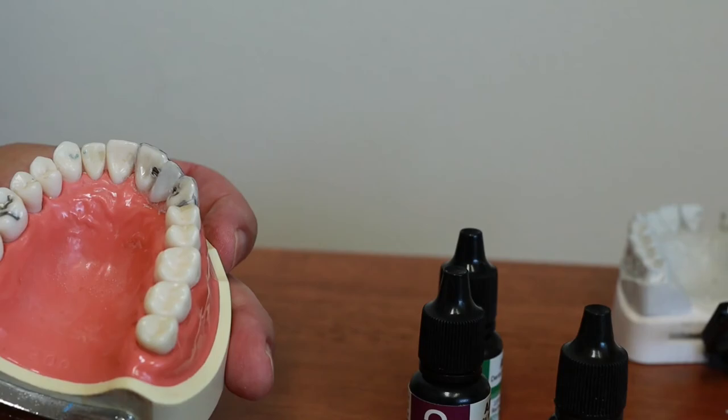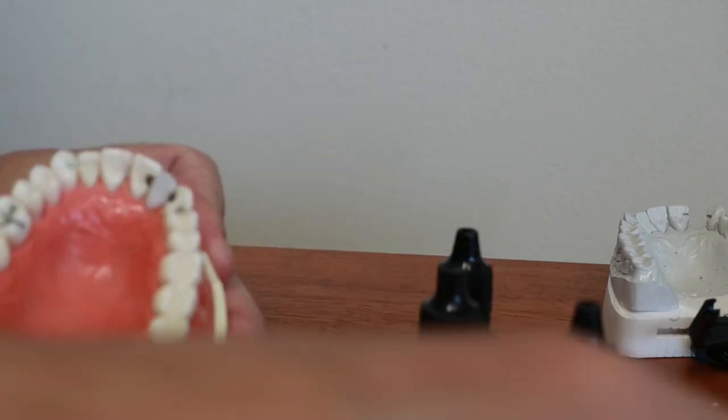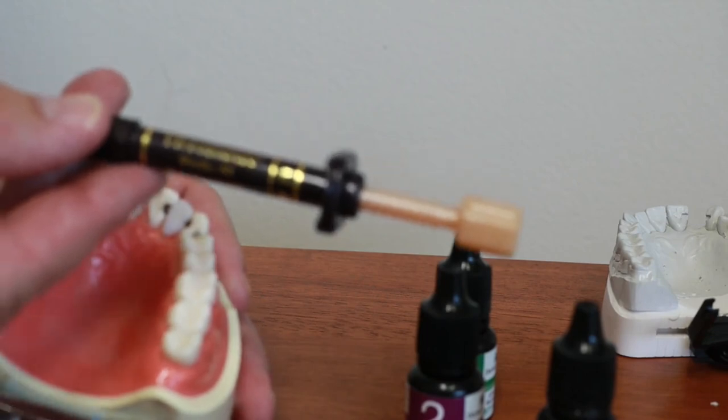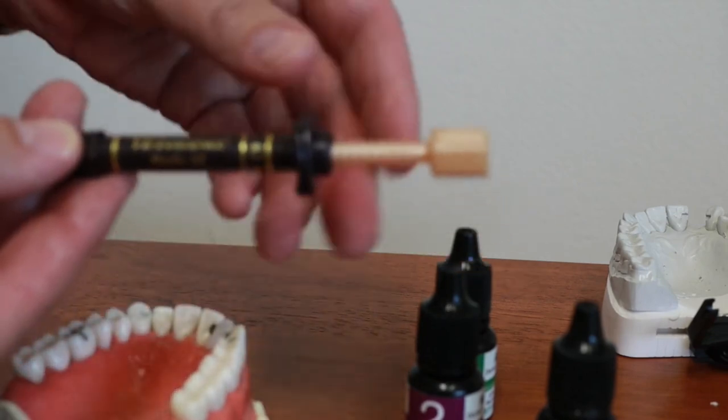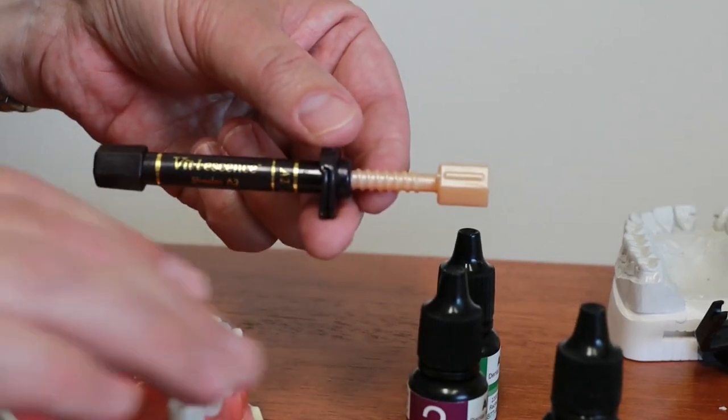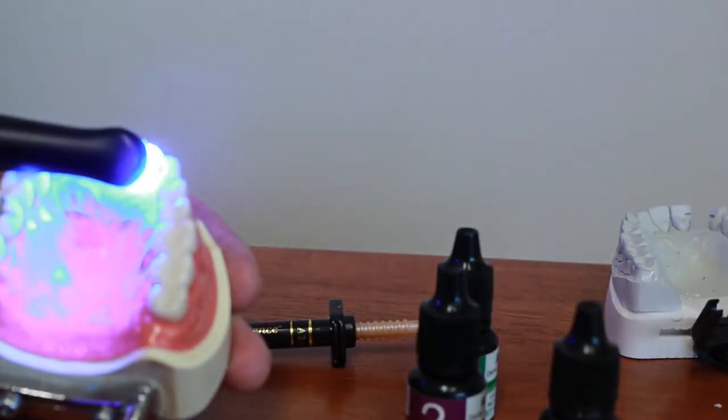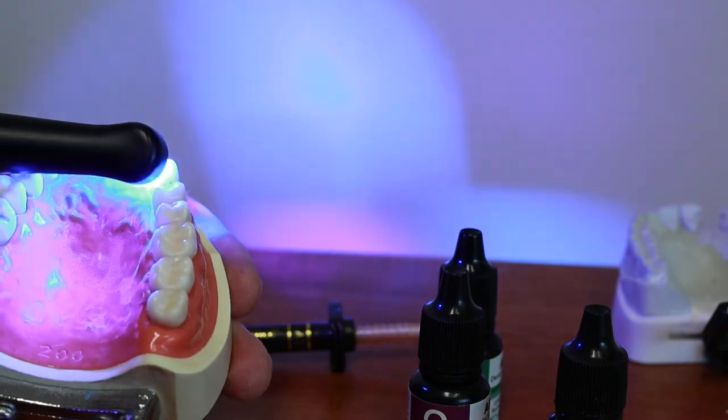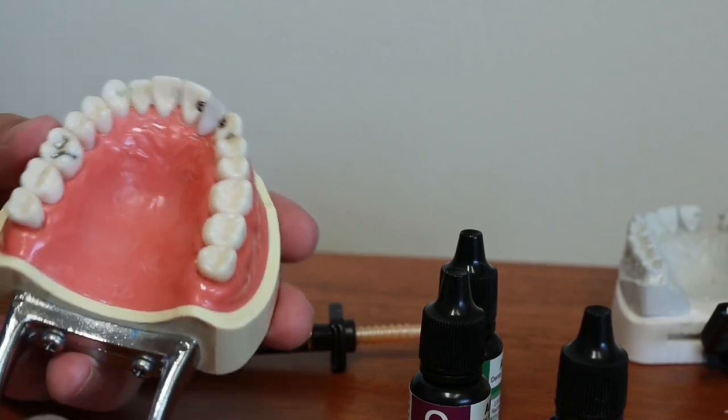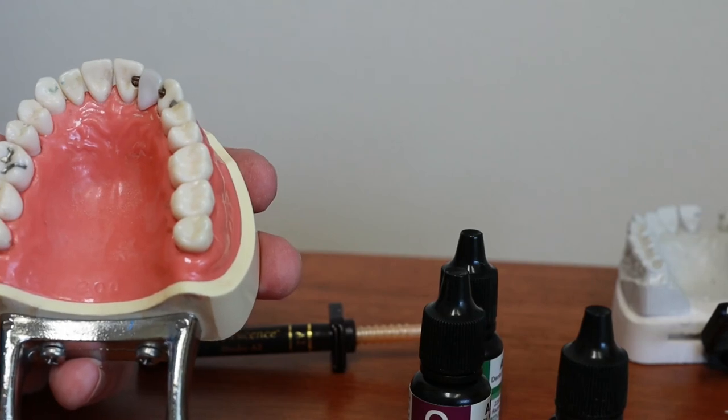Now the bridge is pretty much glued into place but still have to fill in the preps. For that I'm going to use a firmer composite. I use Vital Essence by Ultradent. I just cover up the holes, smooth it. Once it's in there, zap it with the light again. And now it's in there. Now I'll check the patient's bite, make any adjustments that I need to. And then once I grind down the bite, polish it up, and then that's it. The patient can go home and wear it.